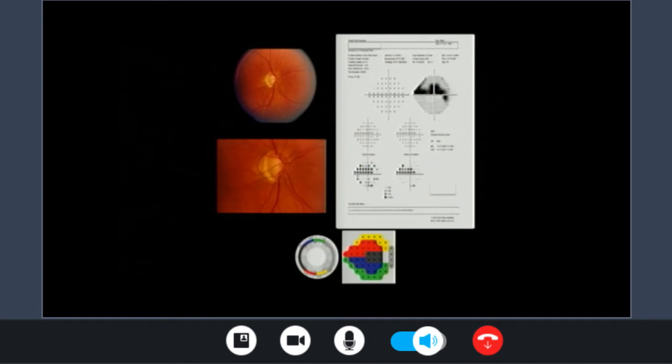We looked at the age, it's the same age, same ID, same pupil diameter. Then we will go for the defect, right? We looked if it's normal or not, it's abnormal. We go for the defect, we have a dense superior scotoma, and here it's dense. On the pattern deviation, it's a dense superior scotoma. When we go for the mean deviation, how much is it? Minus 10. So mild, moderate, or severe? Moderate. Look at the pattern standard deviation. It's 12, right? Why? There is a huge discrepancy in the visual field between the superior and inferior sectors.